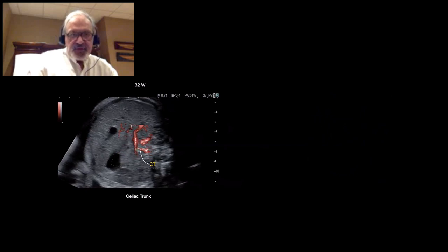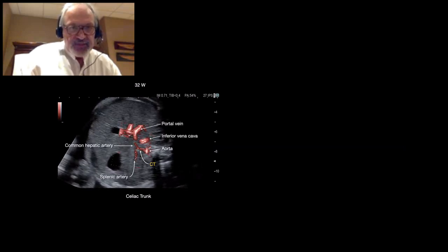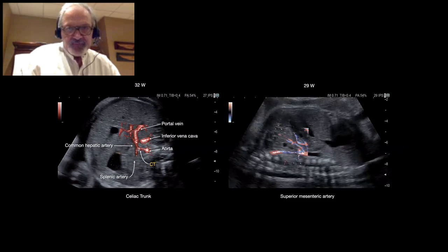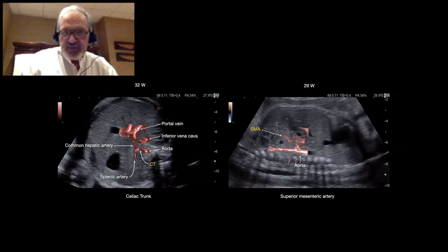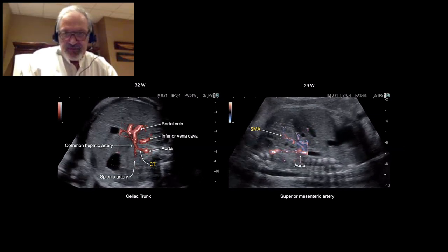Here, we have the celiac trunk coming from the aorta, bifurcating into two branches — on the left, the splenic artery, and on the right, the common hepatic artery. We can also recognize the inferior vena cava and portal vein. Here, we have the superior mesenteric artery going toward the small intestine. It's unusual to see these small vessels so easily.